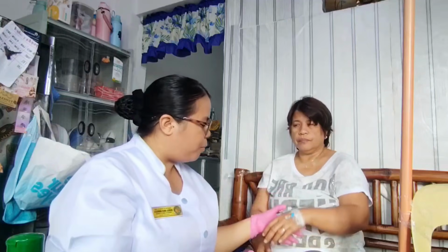Okay, so after that we're going to proceed in assessing the IV patency for any signs of hematoma, bleeding, infiltration, leakage, and infection-related IV complications. Okay, so ma'am, check ko lang po yung swero nyo po.